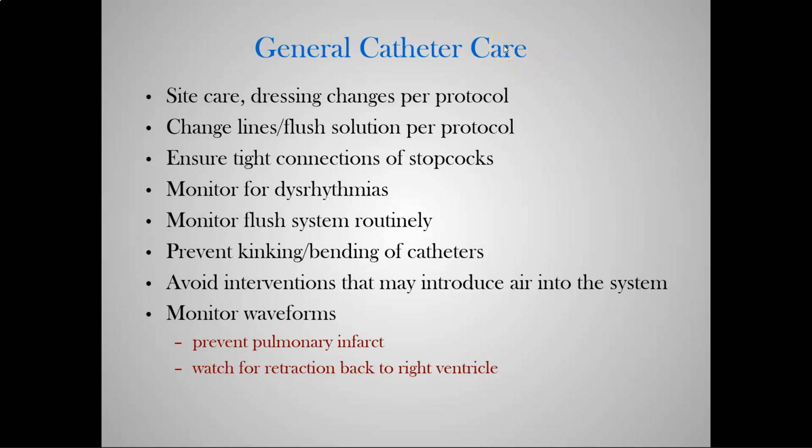And you could technically advance it past the right atria into the right ventricle, and then you get a whole lot of tickle tickle and that electrical funky boogie dance that the heart does, and that's called a dysrhythmia as well. We don't like that.